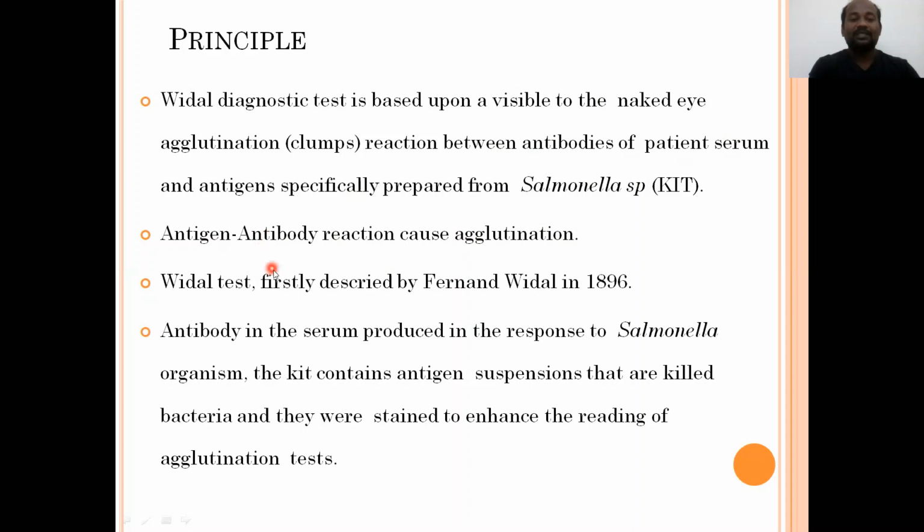This test was described by Fernand Widal in 1896. So it's a very old test, but it is still there in the clinical laboratory as physicians are recommending this test for the diagnosis of typhoid fever. You know, old is gold.